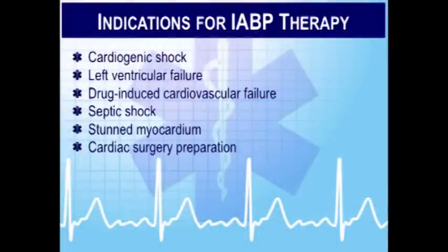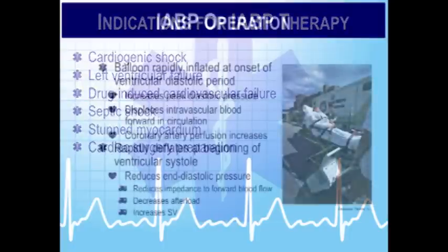So it's indicated for cardiogenic shock, left ventricular failure. Those are the two most common things. Stunned myocardium, cardiac surgery probably the next. The use of it in septic shock and drug-induced cardiac failure, not so much. The company will tell you that, but in reality, we're not putting balloon pumps in people in septic shock, cardiac failure as a result of septic shock. It's not going to work really well, and it's not going to change the outcome.